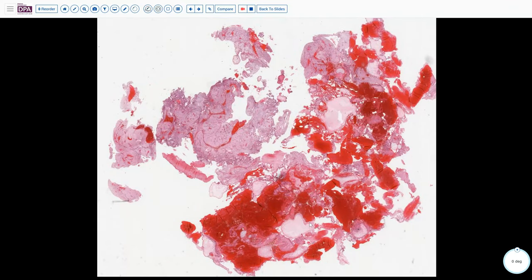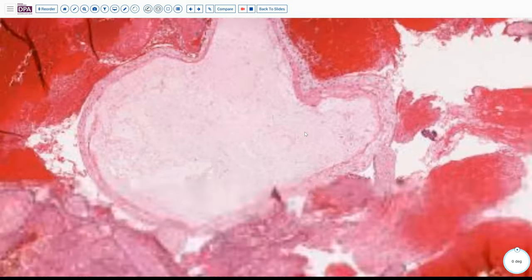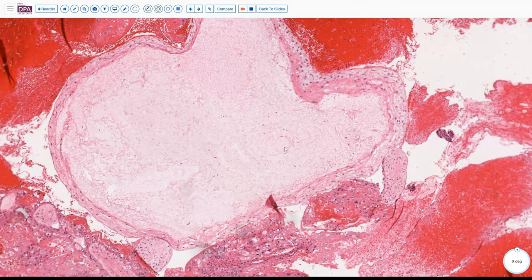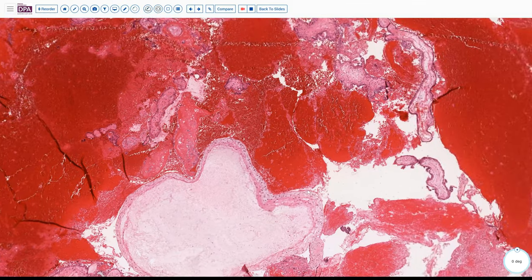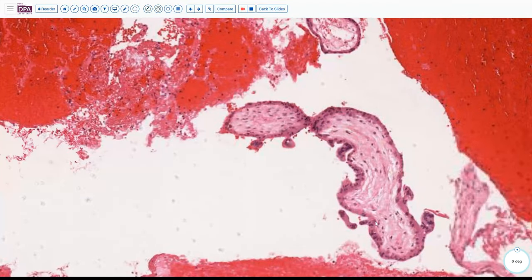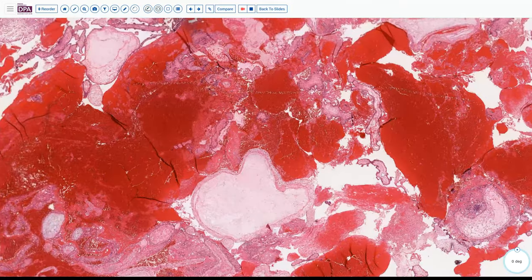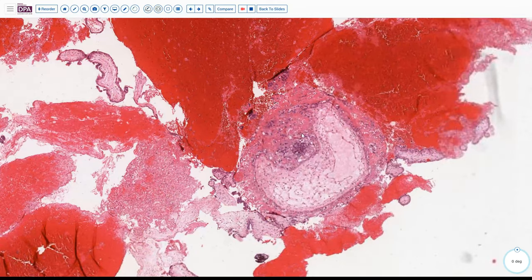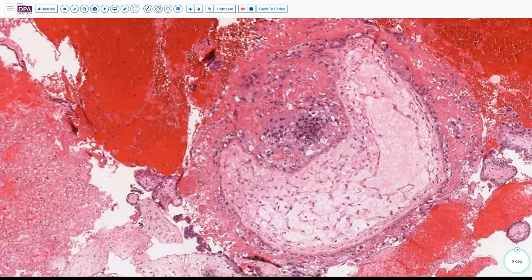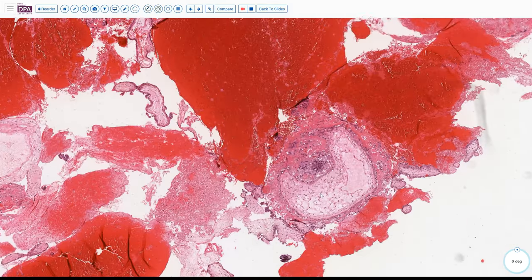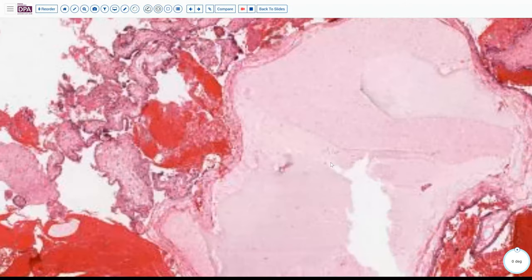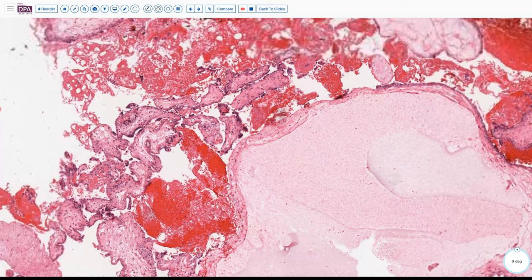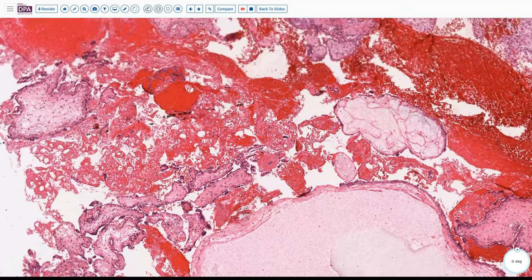Here's another case just for comparison. Here's a nice edematous cistern centrally, peripheral trophoblastic tissue, a few other villi — not so edematous, not much in the way of trophoblastic proliferation in this case. So we might be thinking this is just a blighted ovum perhaps. Then here's a villus with maybe a little bit of trophoblastic proliferation, a small cistern, edema, but not much in the way of atypia. This case also was found to have absent p57 staining. So you can see there can be quite a bit of variability in the degree of trophoblastic proliferation and the pattern of villus edema and cistern formation in these lesions.